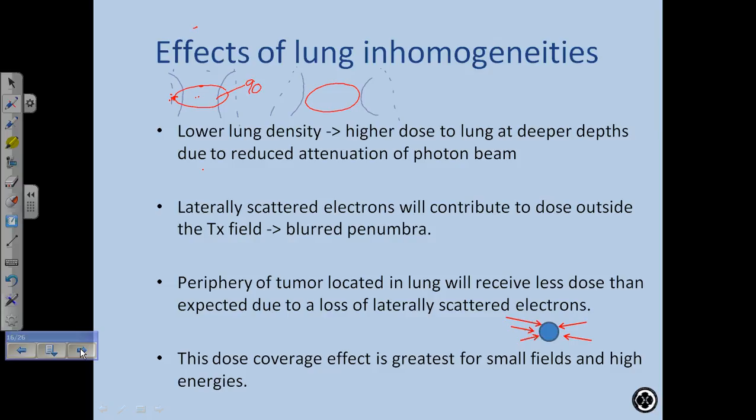And then also, don't give the doctor a plan that's got some insane hotspots. He's not going to have much trust in you. So you need to understand from the back and forth discussions with the physicians when you're planning, you'll get a sense of what their tolerance levels are. And different docs have different tolerance levels for hotspots and for coverage.